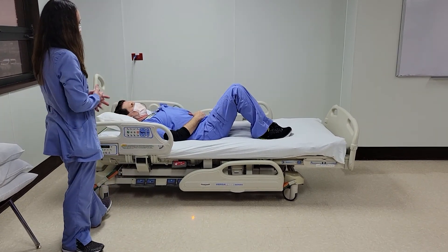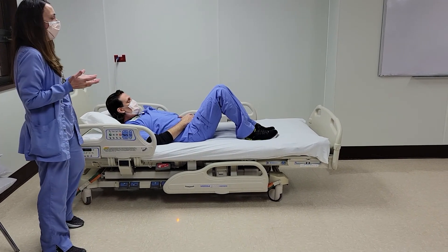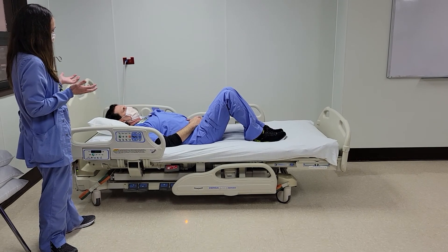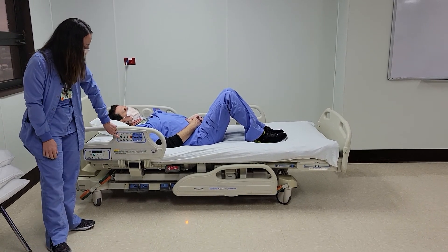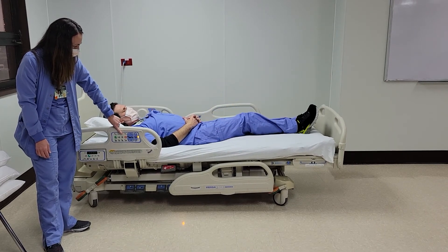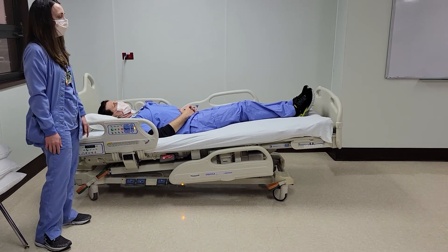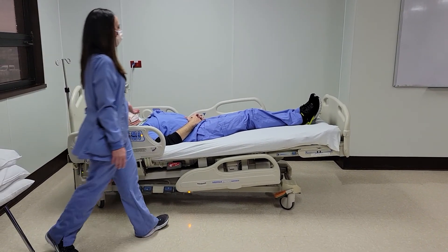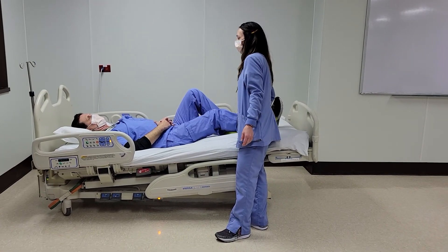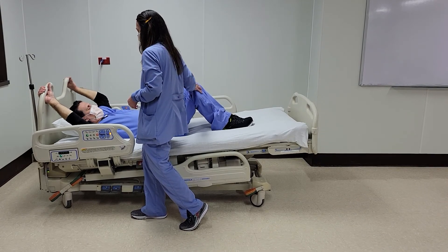There are a couple things we could do in this position to make things easier for you and the patients. We could start with putting the bed in Trendelenburg position — this is going to help with scooting. You use the key here to Trendelenburg the bed. Anytime you're going to have your patient scoot in bed, you want them to help you as much as they can. Steve's going to bend his knees, grab the rails, and scoot up if needed.